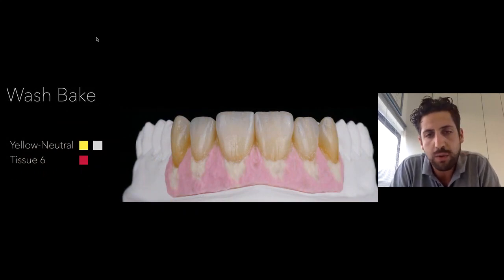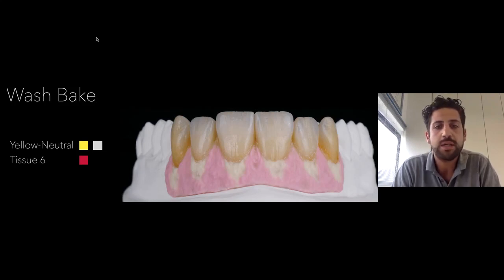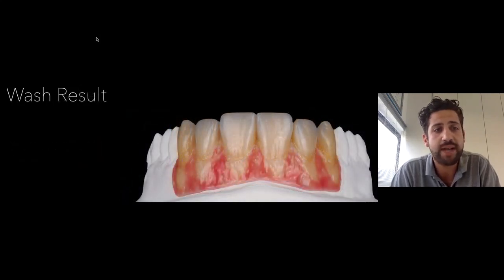First of all, it's really important to make a wash bake to create the adhesion between ceramic and zirconia. For the wash bake, I like to use yellow dentin and neutral dentin to make the root, and tissue 6 just between the roots and in the interproximal side, to receive the dark bottom of the gingiva. This is the result after the wash bake.